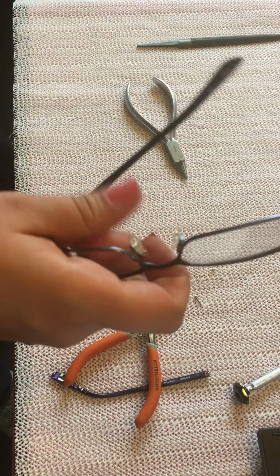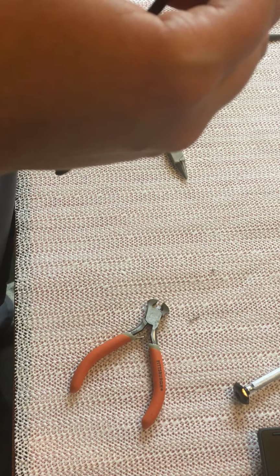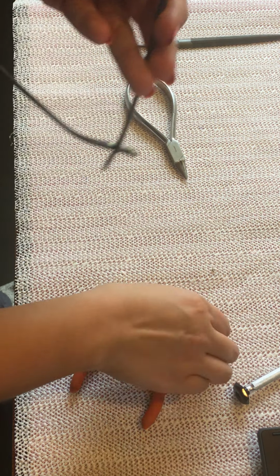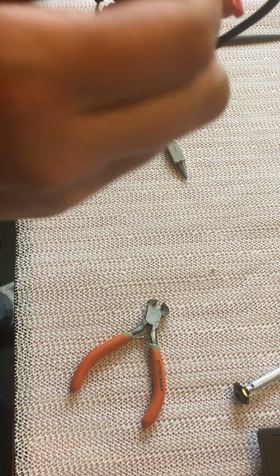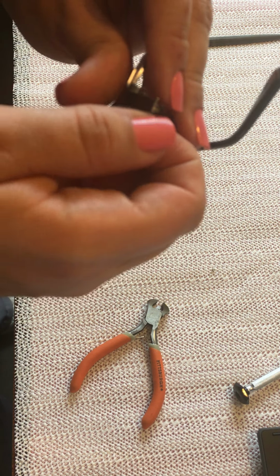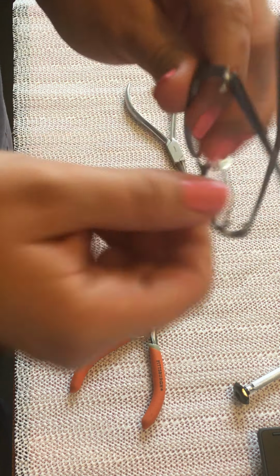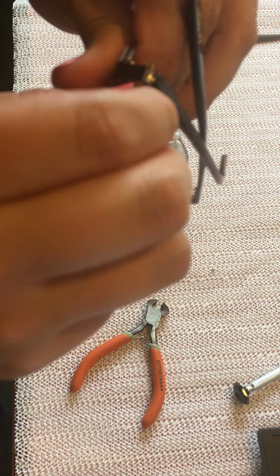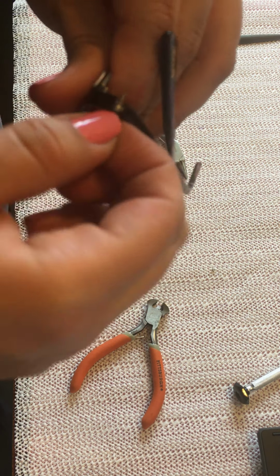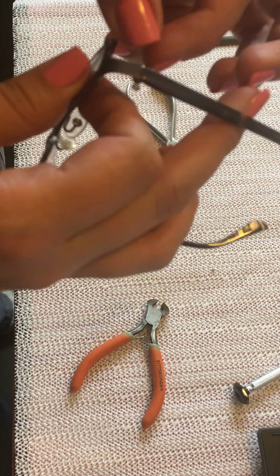I'm going to try to work on the other side. Maybe we have better luck on this side. I'm going to screw with my finger as much as I can. Okay, so this side seems to go in smoother with my finger. I'm still turning it.